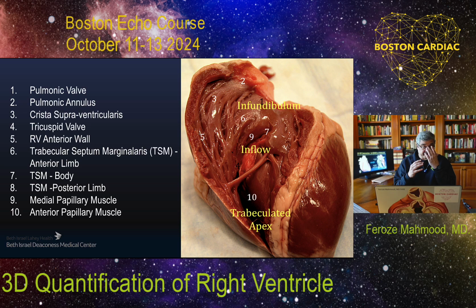It is something that you can see and how it wraps around the left ventricle. You can imagine the way it is oriented in the heart, but it is very difficult to draw this anatomy from a single perspective because it looks pretty different from different angles and different perspectives.